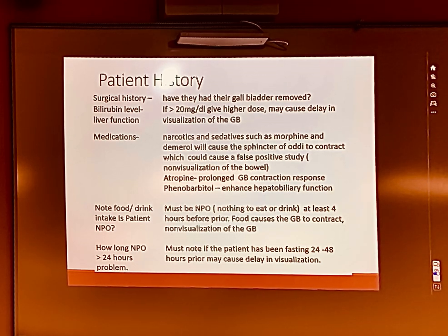That dose can be up to 10 millicuries. We're going to go into what doses are in just a couple minutes. What kind of medications do these patients have to be either on or off of? If you're looking for biliary atresia, your baby needs to be on phenobarbital to enhance that hepatobiliary function.